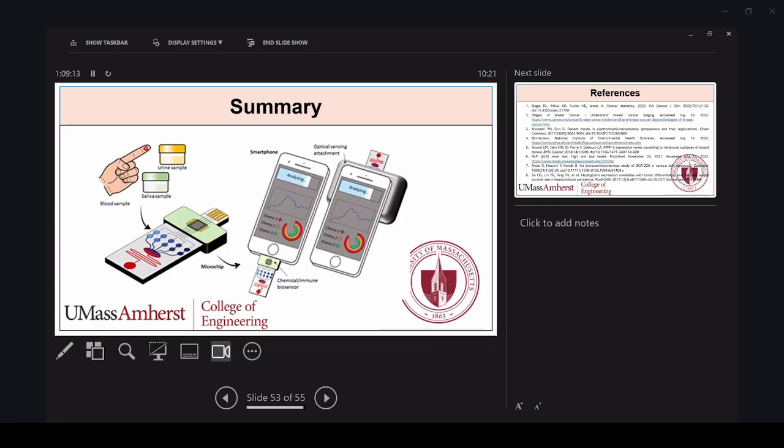So this processor, where we fed all these trained models, just gives you chemo 1, chemo 2, or chemo 3. For us, we just have to give low risk, high risk, or normal. This is our main thought in creating this type of device. You can also use optical biosensors to combine and create this type of microfluidic device. Yeah, so this is how we did the research.